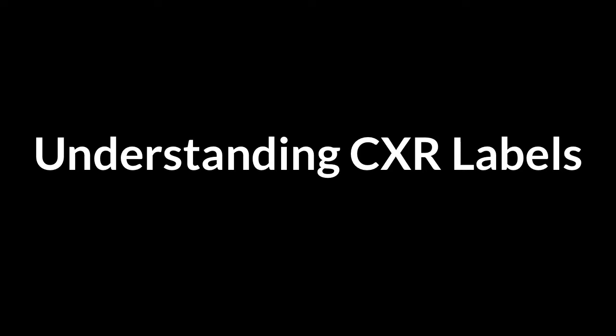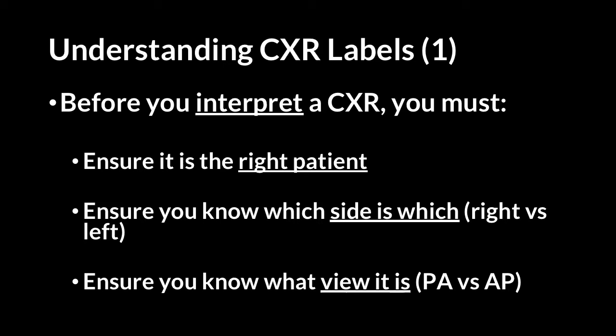Now let's go through the labels you'll often encounter on a chest X-ray. Before interpreting any chest X-ray, there are three things you must do: ensure it is the right patient; appreciate which side is right versus left by looking for the L or R label; and make sure you know what view it is — this is where the concept of PA view versus AP view comes into play. On the chest X-ray shown, you'll also see nipple rings, used in some female patients to denote the nipple region, as dense areola tissue can incorrectly be mistaken for pathology.